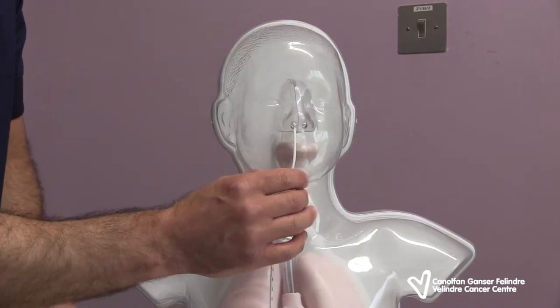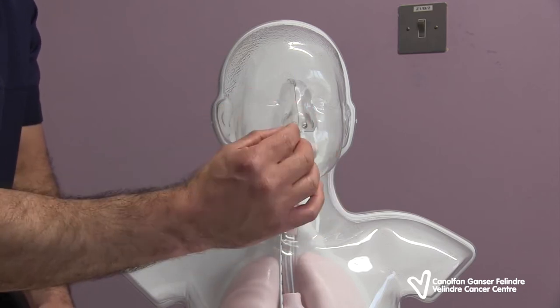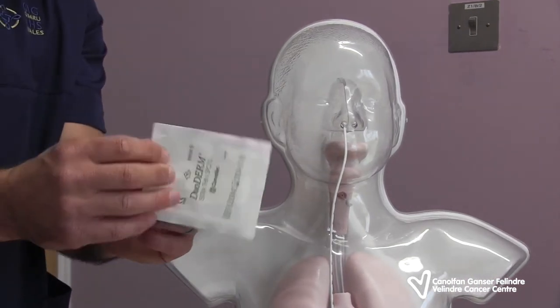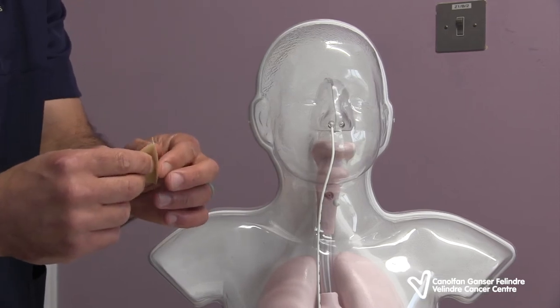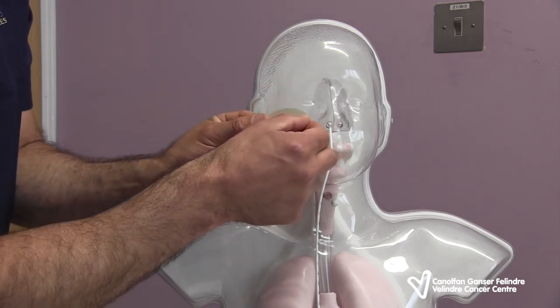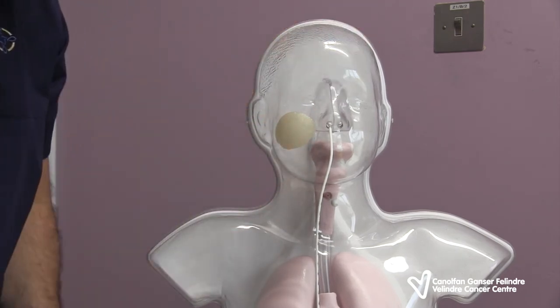So in order to replace your nasogastric tube dressing, ensure you remove the old one, but make sure that you have the NGT secure so it doesn't fall out. You could get a family member to do that for you. So once you remove the old one, if you open up your Duoderm spot, this dressing will be placed onto your cheek. Get it as close to your nose or the edge of your nose as you possibly can. Make sure that's nice and secure on your cheek.